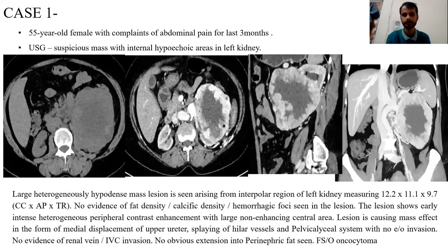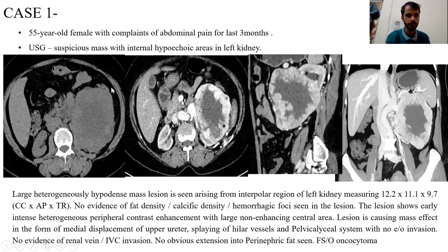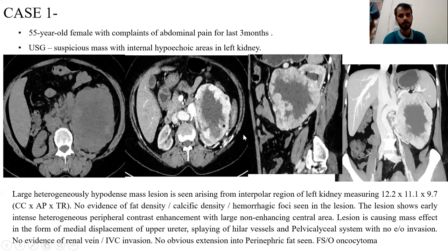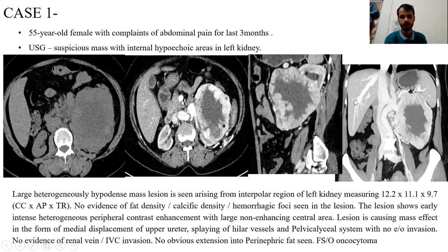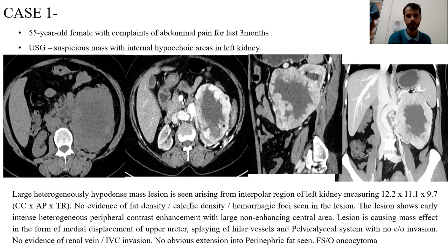Case 1: A 55-year-old female presenting for the last three months, with ultrasound showing a suspicious mass with internal hypoechoic areas in the left kidney. On non-contrast and contrast CT images, the mass is large but shows no evidence of direct fat infiltration. The mass is displacing the great vessels, as opposed to invading them, with no intraluminal thrombus within the vessels and a normal collecting system. This large mass is still confined within a fine capsule and not invading adjacent structures. This is a case of oncocytoma.